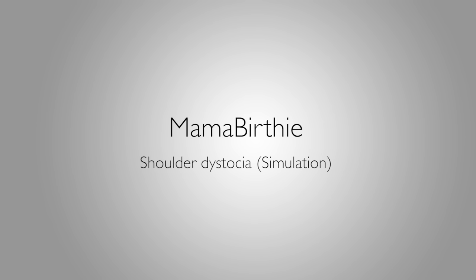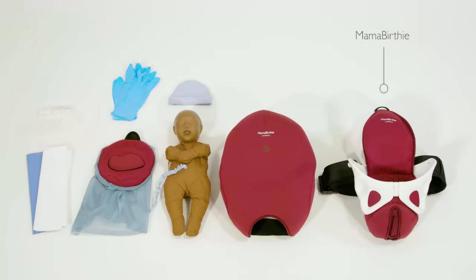This is an instructional video showing how to use Mama Berthi to perform management of shoulder dystocia. For this simulation you will need Mama Berthi with abdomen skin, baby Berthi and the placenta.